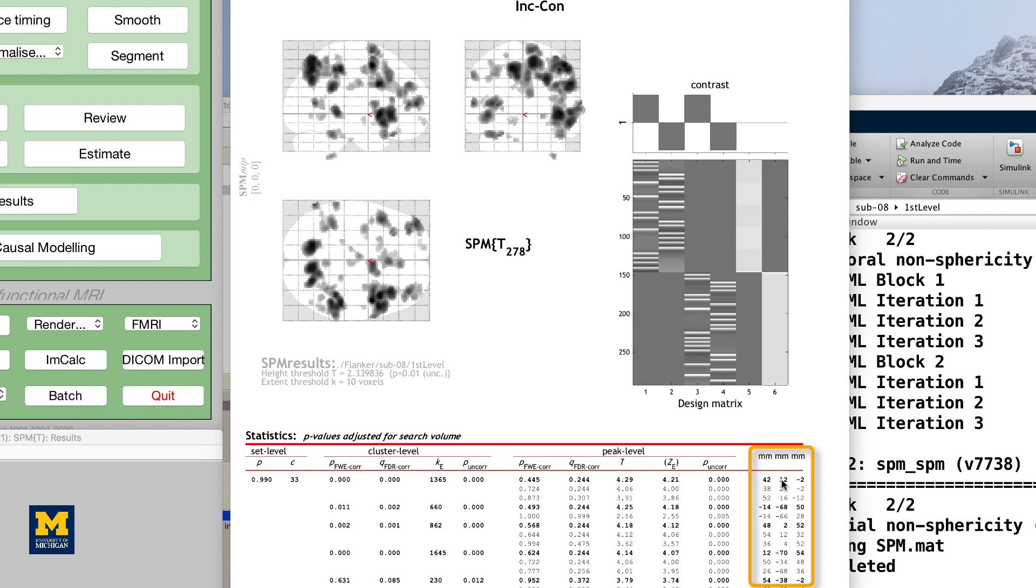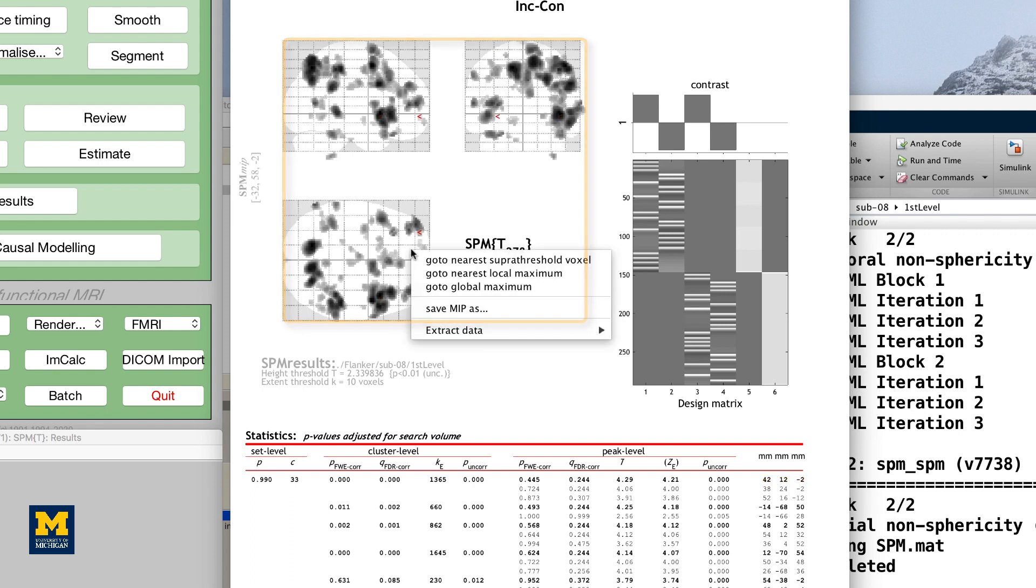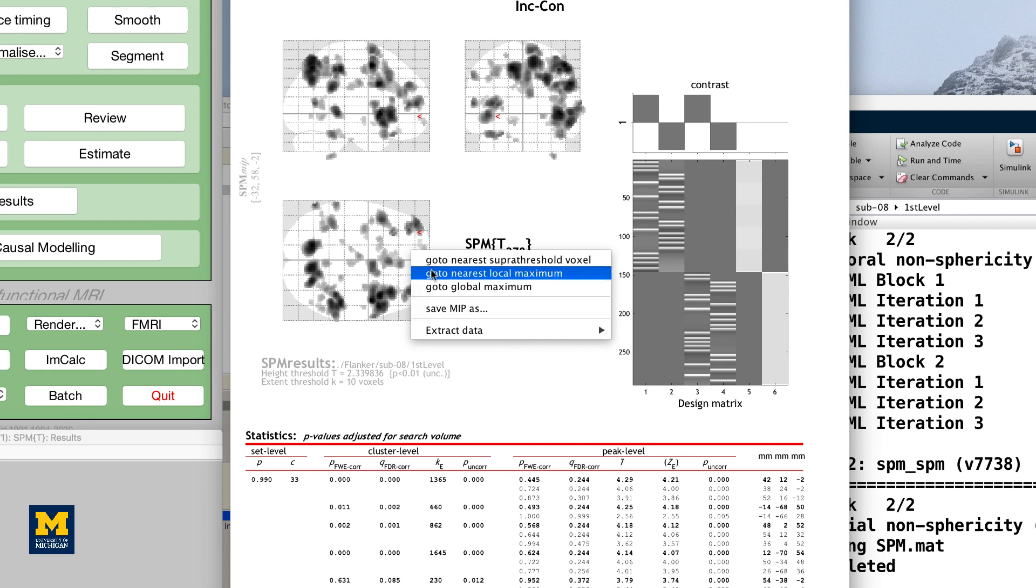If you left-click on the coordinates for a cluster, the coordinates will be highlighted in red, and the cursor in the glass brain view will jump to those coordinates. You can click and drag the red arrow header in the glass brain if you like, and then right-click on the brain and select any of the options for jumping to the nearest super-threshold voxel or the nearest local maximum.